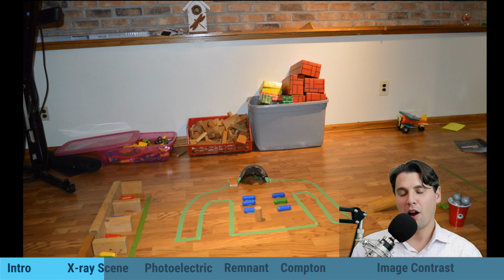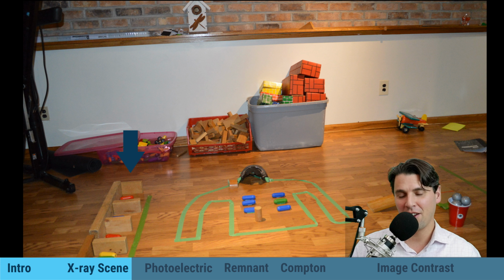And then, for instance, our patient here has ribs, and you can see those ribs right there in the middle. In addition to the ribs, we also have some other tissue, which could be scattering the X-rays. Those are demonstrated there as well. Then you can see at the end our simulated detector. These wooden blocks at the end are the simulated detector. So again, we'll be rolling the X-rays through the patient, and they potentially could interact in the patient or cross on through and get measured in the detector.